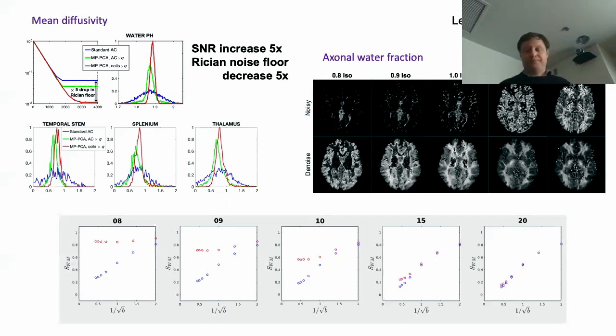So when you do this, you start with the data from each coil. You take basically a square blob of it across all the different directions. Do a PCA truncation. A good way to truncate. I arrange coils, q's, and voxels in a clever way.